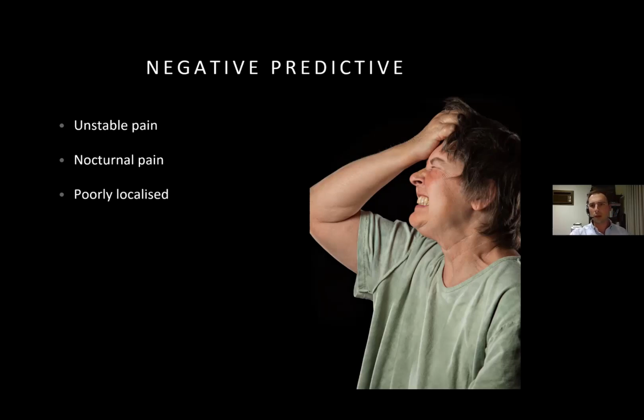Pain that's poorly localized. You've got difficulty palpating, working out exactly where it is. If you just think about that, where are you going to target your shockwave? That can be hard to do.